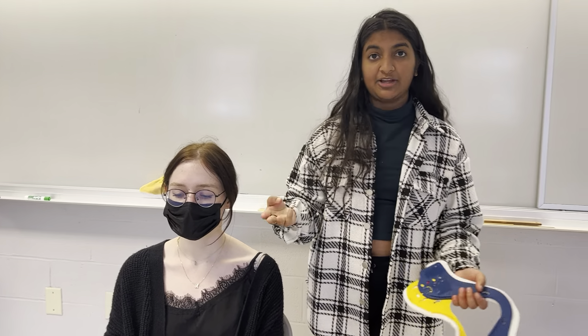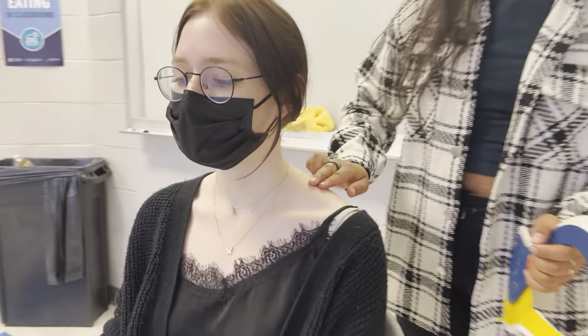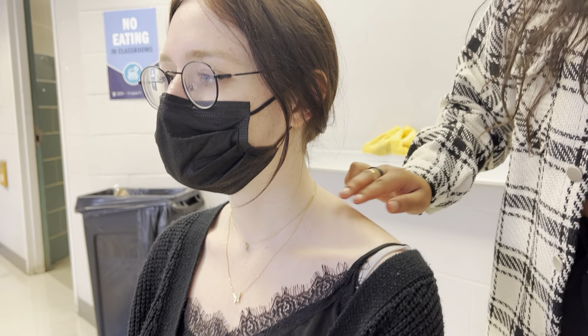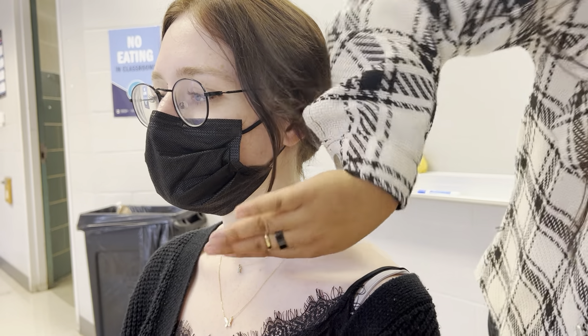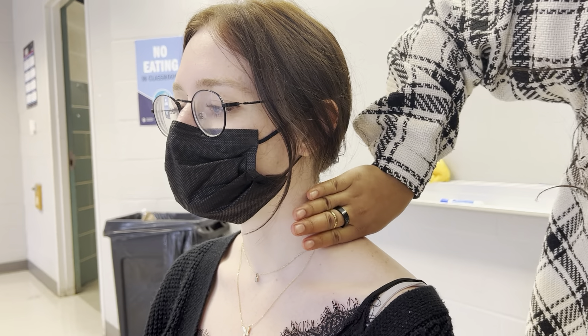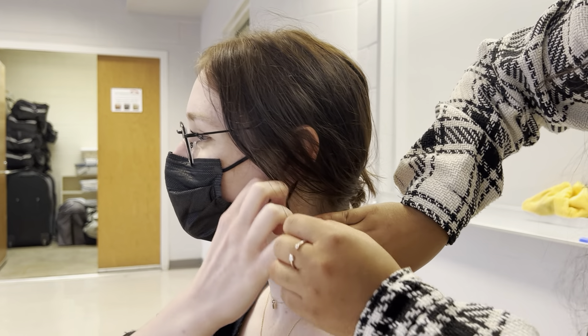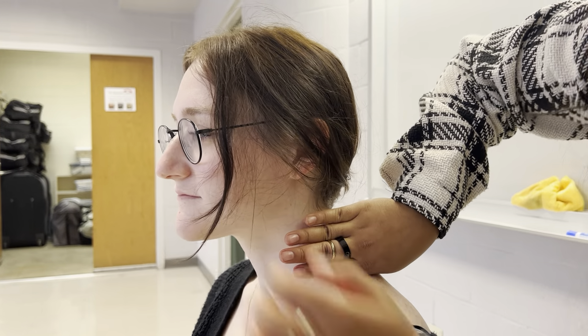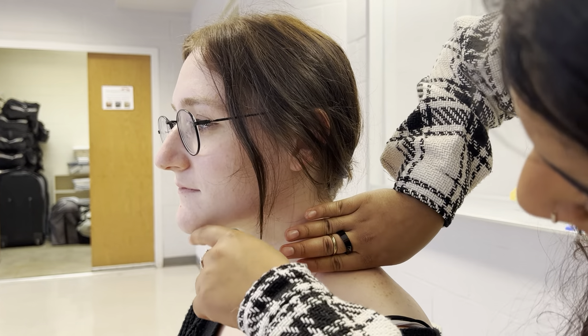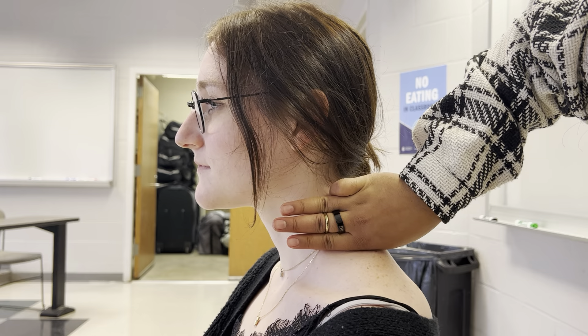The next thing you want to do is take your fingers from the top of the shoulder where the C-collar is going to sit, to the bottom of the chin, about right here. I'm going to take my fingers and put them right here — and I'll ask you to take your mask off so we can see this. Looking right here, it's about three, maybe three and a half fingers — three looks about right.